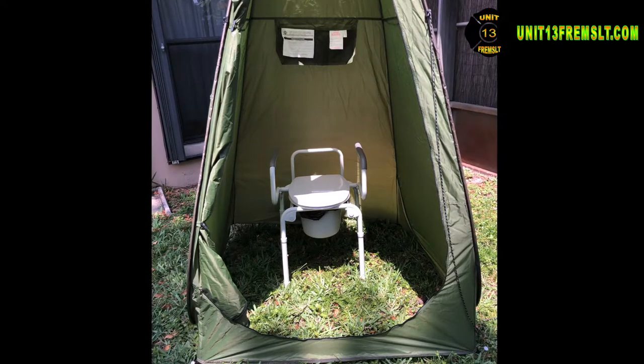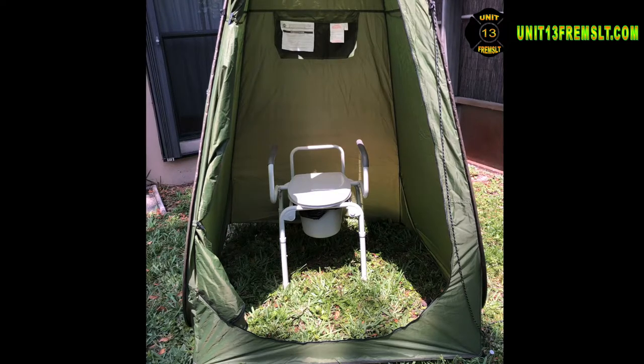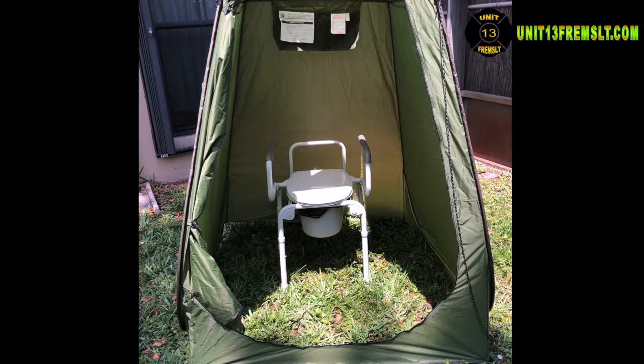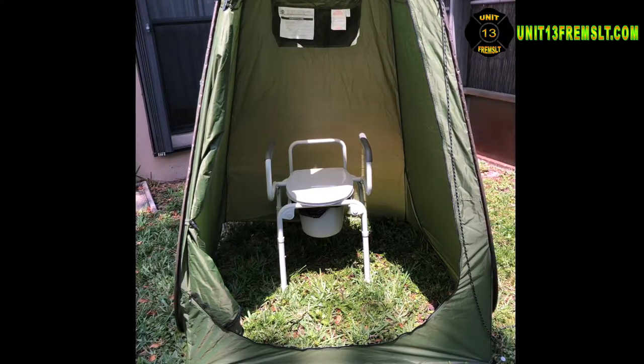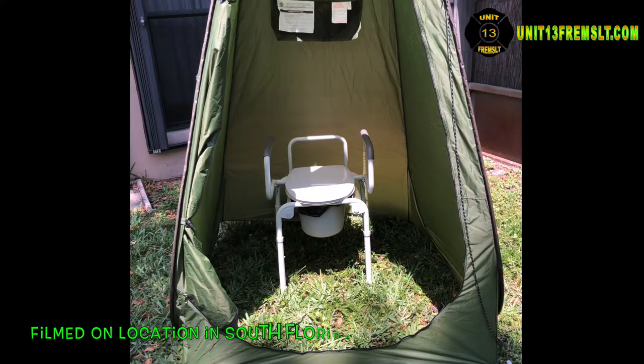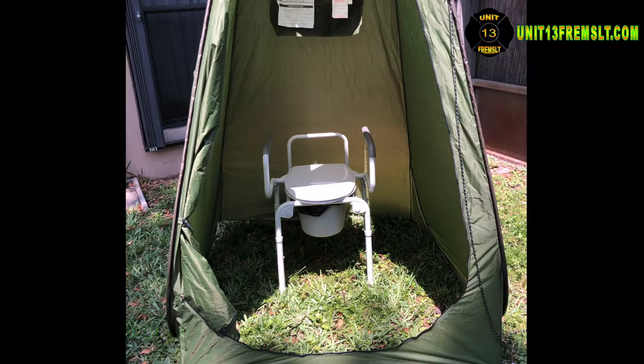There's also another one set up in one of these pop-up shelters that's big enough to set up a shower and have another commode in it. These things are super handy and well worth making the effort to get one — especially if you can get them really cheap off Craigslist. It's a really good deal.